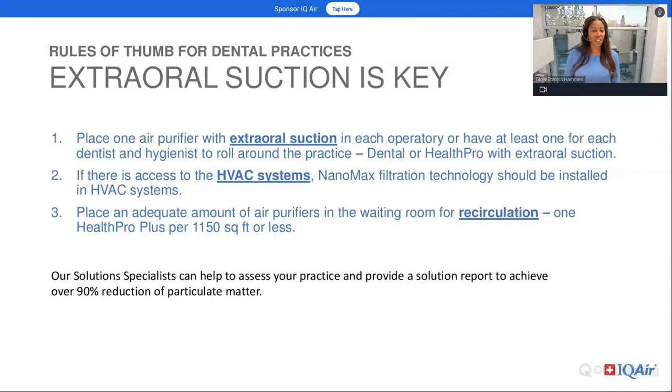Yes, so the key is extraoral suction. You'd be really surprised. We were able to watch that video and see that 15-minute procedure. That's just the coarse particulate matter that we're able to see. Now, of course, the coarse particulate matter we can see only accounts for about 1% of all particles that are in the air.